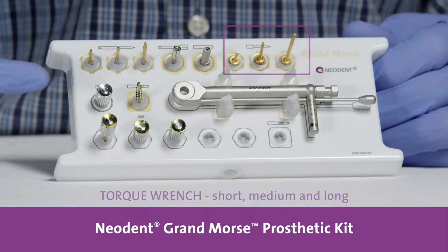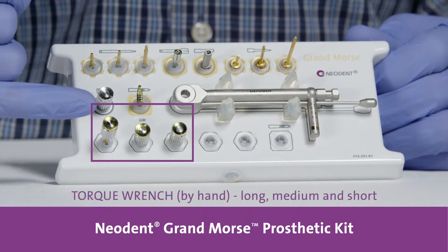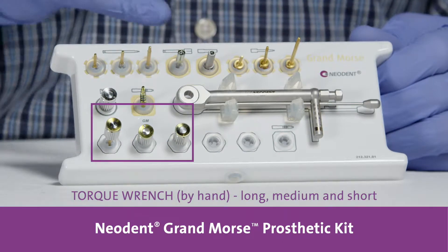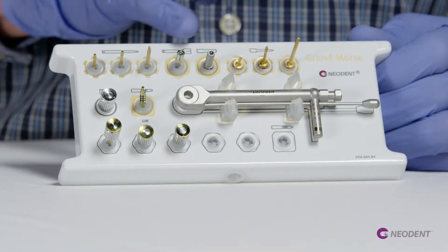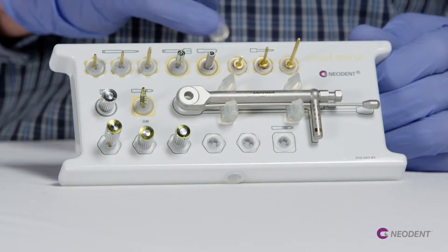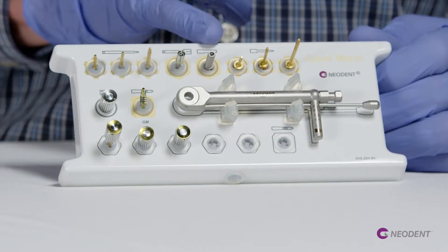And as well by hand or by finger, with long, medium, and short. These two drivers in the center are regarding the straight mini conical abutment, for latch and for torque wrench.